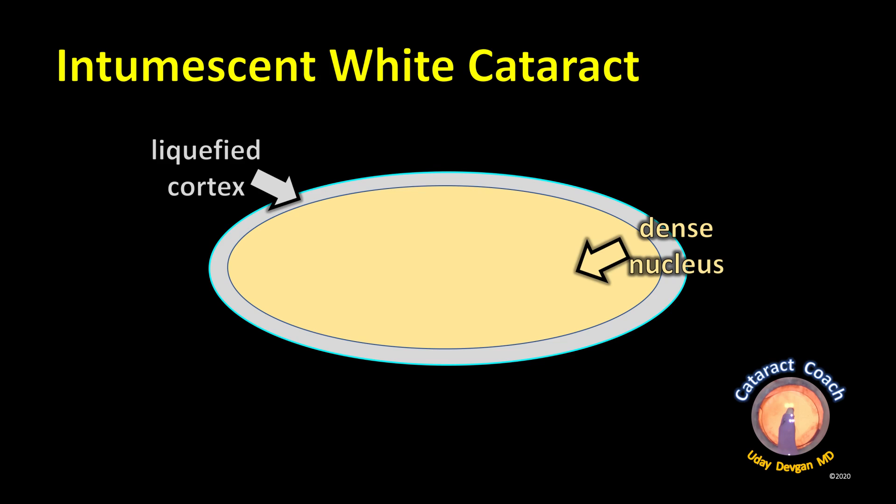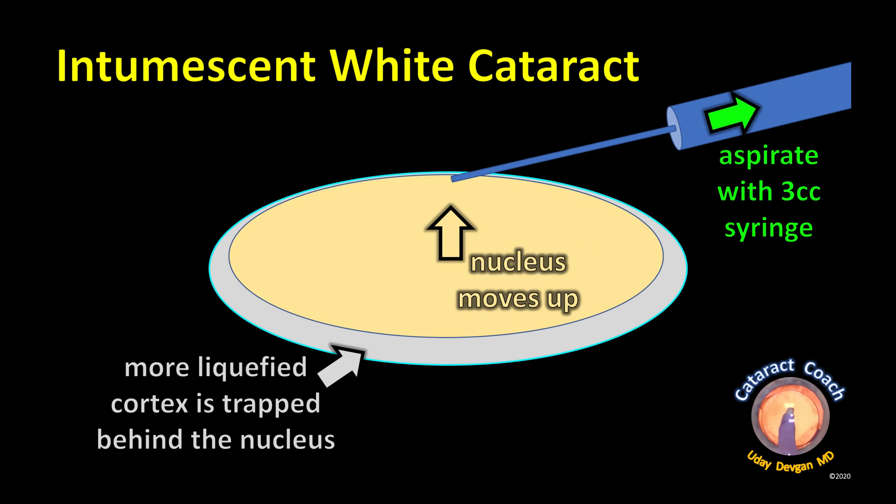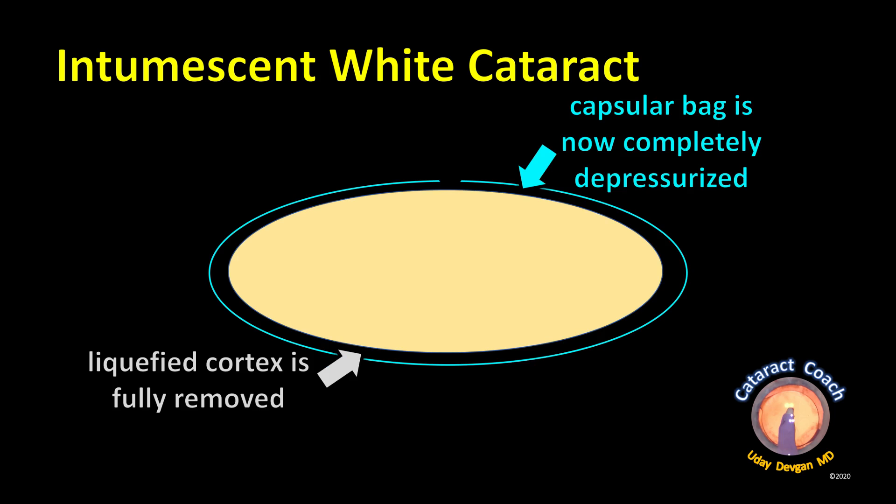Let's look at the diagrams. There's the nucleus, which is very dense. It's surrounded by liquefied cortex all around because all the cortex is liquefied. When we poke in with the needle, lens milk comes out because the pressure in the bag is high. Then we'll start to aspirate using that syringe, pulling back on it. We'll get out all that anterior liquefied cortex, and the nucleus then moves up and blocks the flow. So we need to rock that nucleus back and forth to help release all of the liquefied cortex from even behind the nucleus. Now the capsule bag is completely depressurized, and all the liquefied cortex is fully removed.